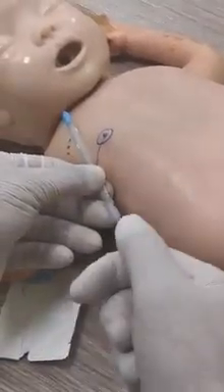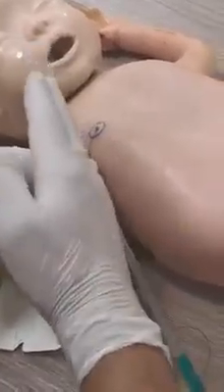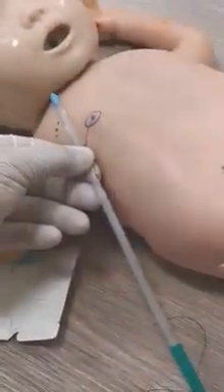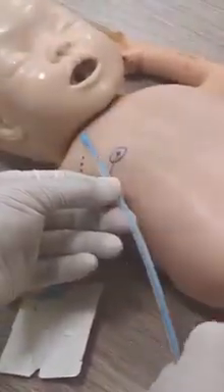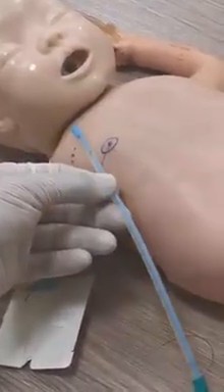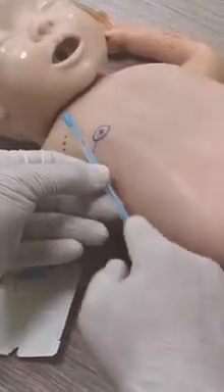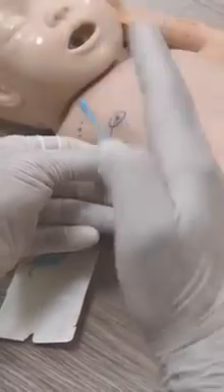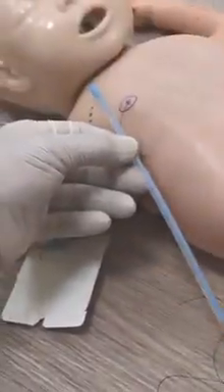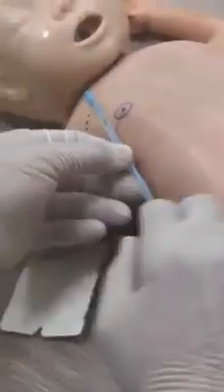Also another point, if you didn't see oscillation, and you are sure that you inserted in the right way, don't panic and think that this ICD is out. Sometimes the air will only fill the ICD and the tubes till the bottle. So don't panic. Sometimes you will not see oscillation, but if you are in, and after that you see the saturation improved or the patient's breathing improved, and you do an X-ray and check the position, everything will be okay. Don't worry.